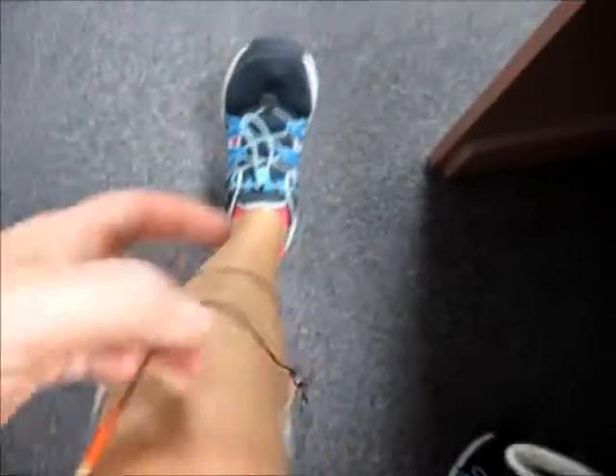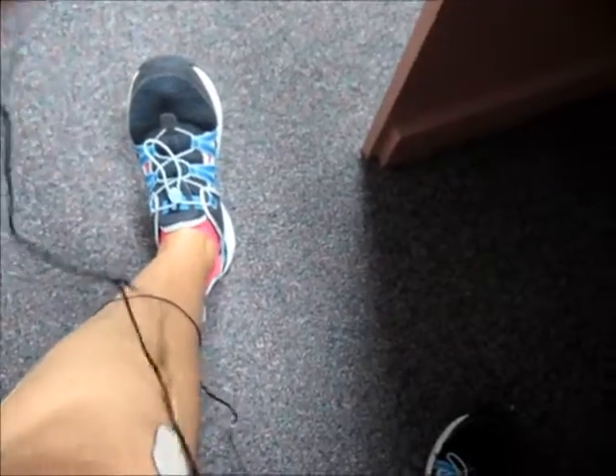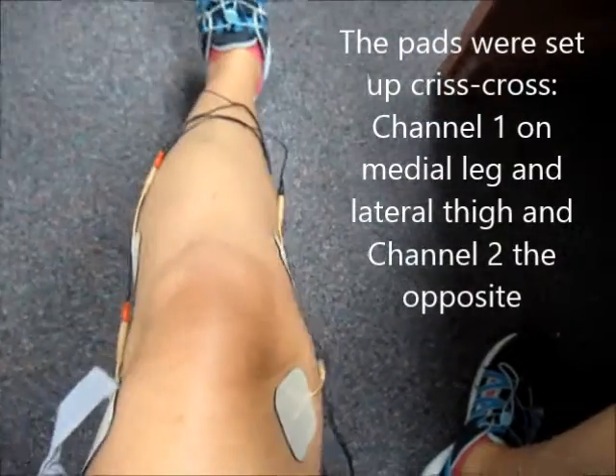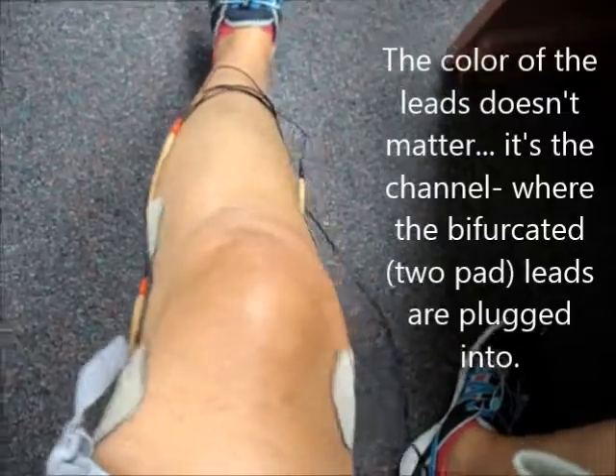The rest of the pads have been located so that this is a quad polar interferential setting. It's setting it up so that this is channel one right here — this is one lead. And then the other two over here, this one and this one, are a different lead, channel two. Remember with these leads, the color doesn't matter at all.